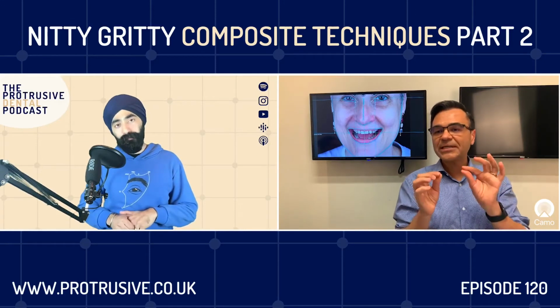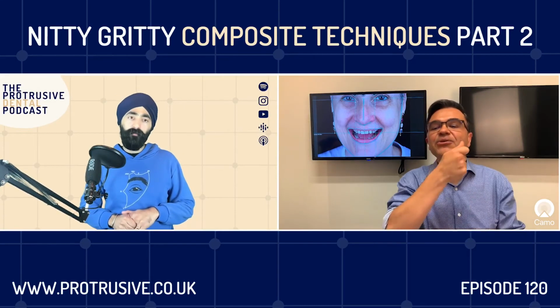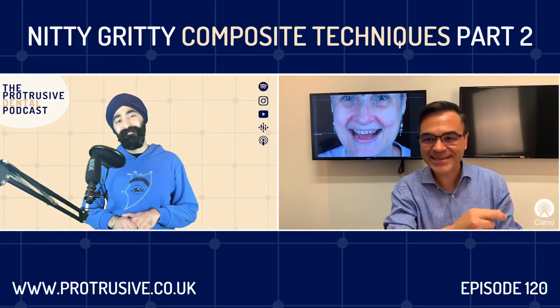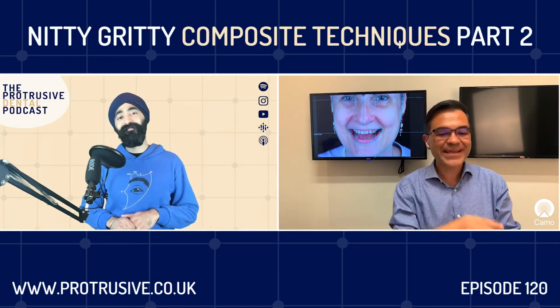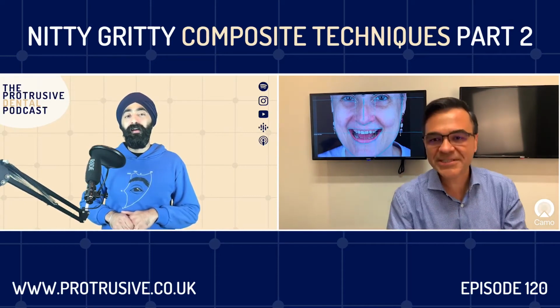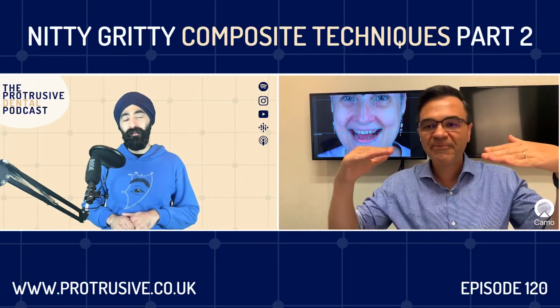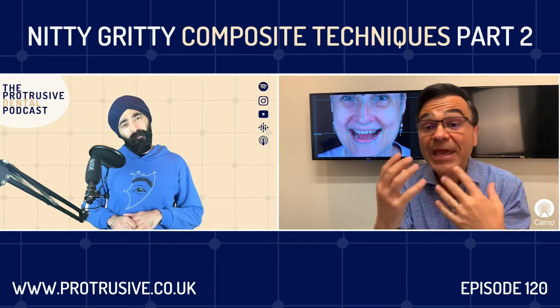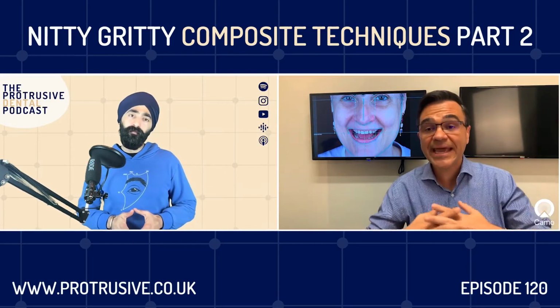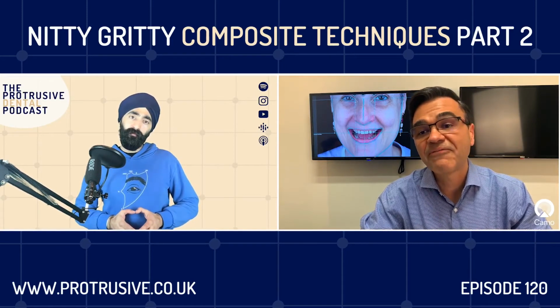But if you want to, you can also use a Fox plane, Jazz. You can put it on your patient with some putty, and you scan that Fox plane, and then you send that scan to your lab technician, and they will have it with a putty matrix, so that they can see that. The big problem that we have now with digital dentistry is that most lab technicians don't know. You tell them about the plane of occlusion, and they don't understand that. That's where we have to educate our lab technicians so that they can take in our digital scans, but make sure that they also follow our instructions with what a Facebow would do.